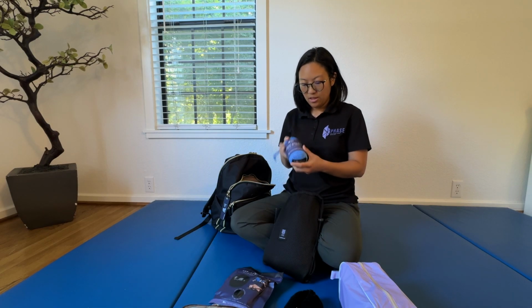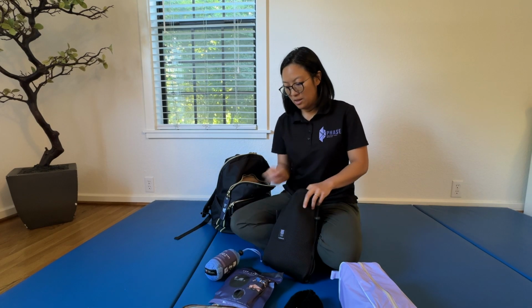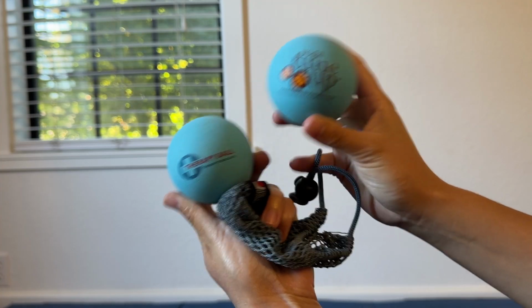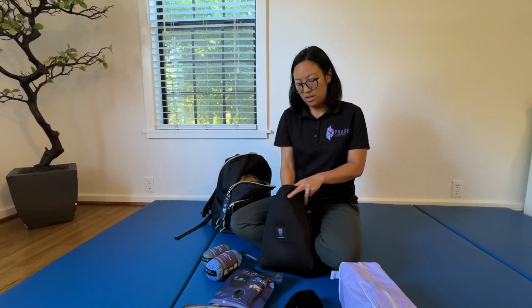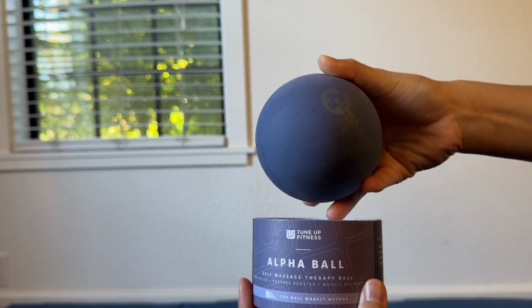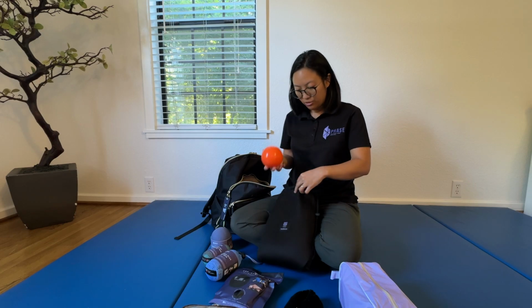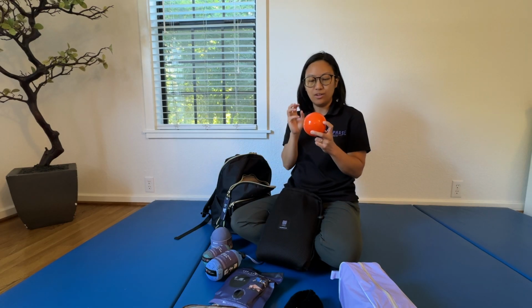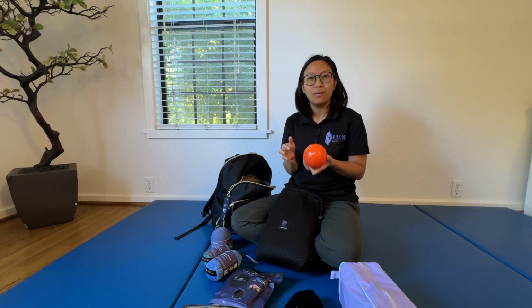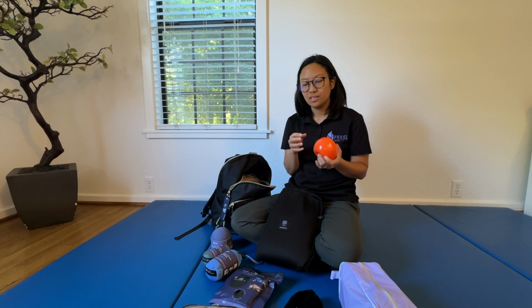I have a therapy ball. This is the plus version. There's also just like the regular version, which is a little smaller. I have the alpha ball, which is a nice soft tissue ball. And then this one I also bought extra and just shoved in here. This is just the Franklin Method ball, 4-inch diameter, off of their website. This is something that Anna Hartman uses a lot as well in some of her soft tissue work.